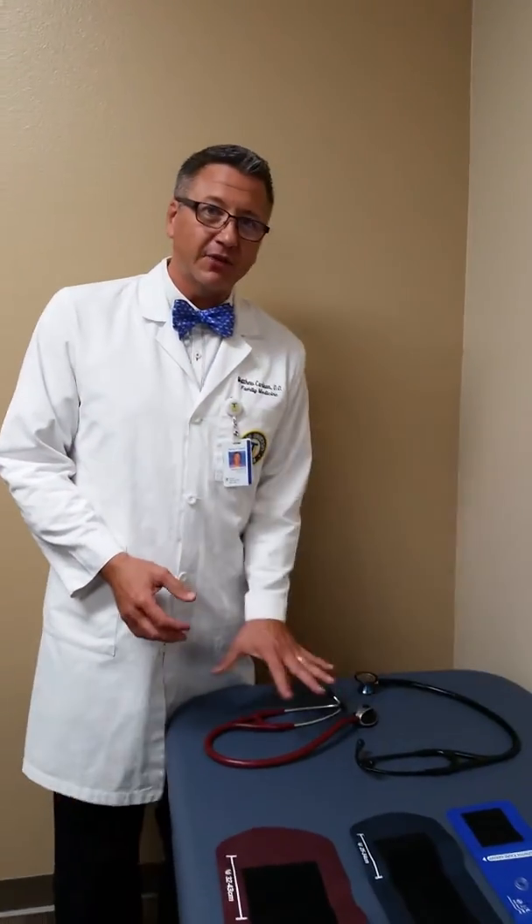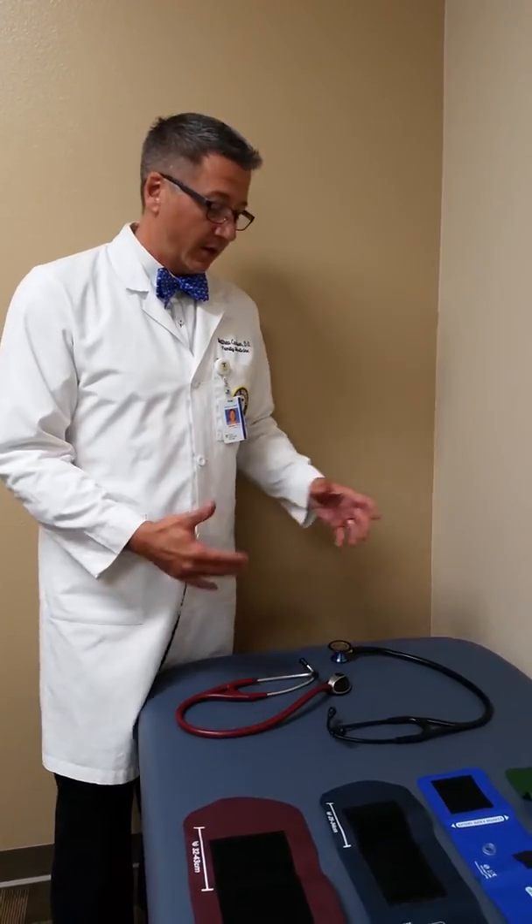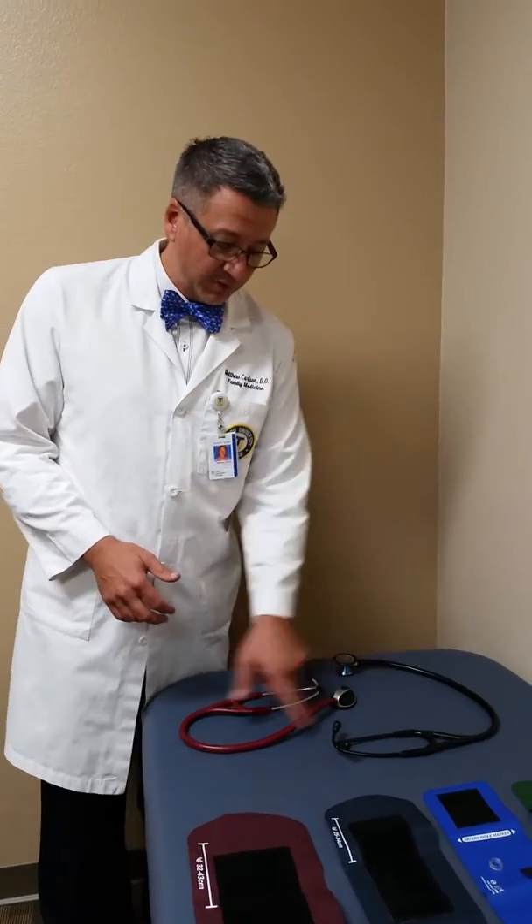These are two different kinds of stethoscopes. They're both made by Littmann. I like Littmann stethoscopes — it doesn't mean you have to get one — but I like their single tube design, because when you get the sprague type, which has a two tube design, those two tubes can rub against each other and produce artifact.